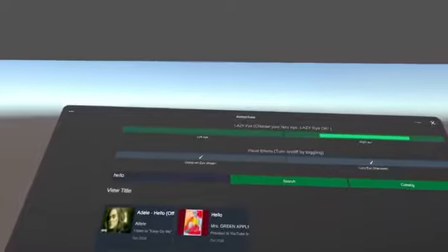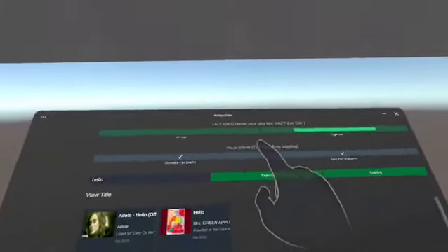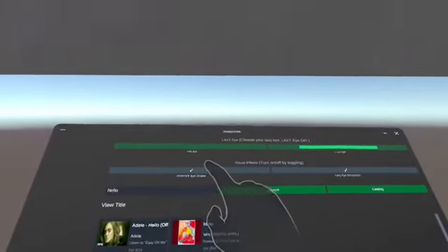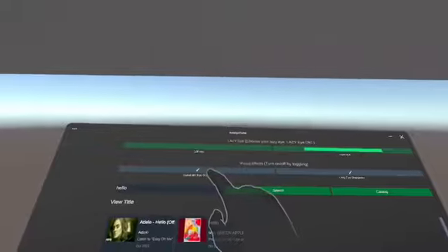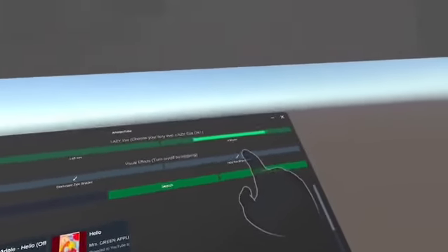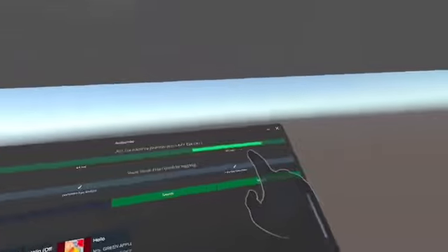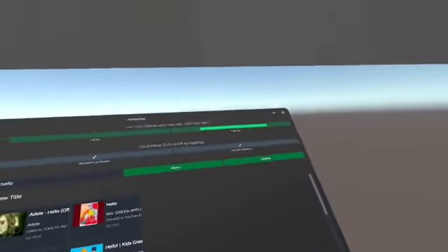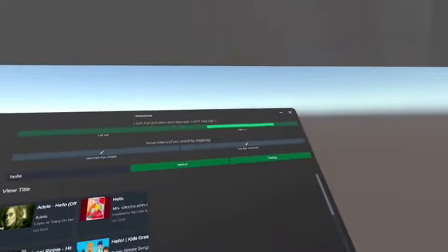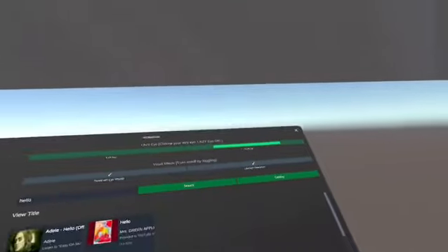There are some separate videos which talk about how the dominant eye shader works at a high level. Basically, at a high level, the dominant eye shader just shades or occludes, working like a patch on the dominant eye. And the lazy eye sharpener is a targeted therapy which works somewhat similar to red and blue glasses, but it is better than that, because it adds flicker, and it can selectively find objects. Right now this targets only human objects.